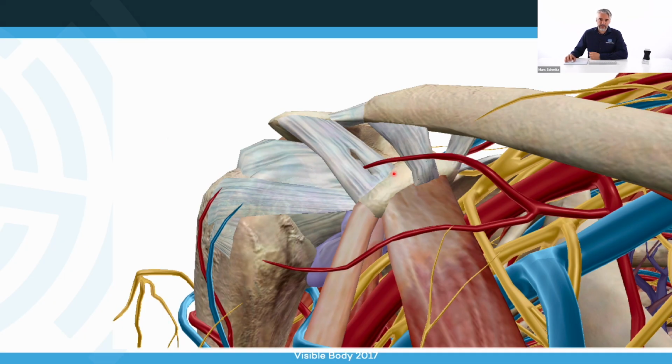And in this coracoid process region, we can have a look at a number of pathologies and number of structures. They fall a little bit out of scope of this talk. Now we're looking at a foundational protocol, but there is so much to tell about the shoulder. There are so many structures there, so there's always more to learn. So we could also do this talk maybe next year from an advanced perspective, and then looking at, for example, the coracoclavicular ligaments. But for today's topic, we will focus later on the coracoacromial ligament and the coracohumeral ligaments.